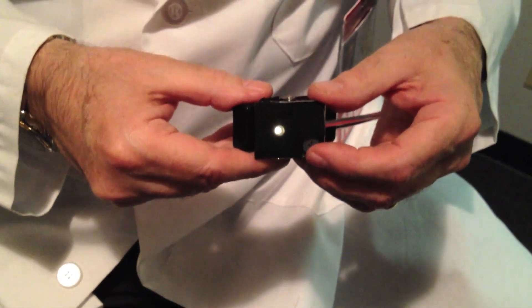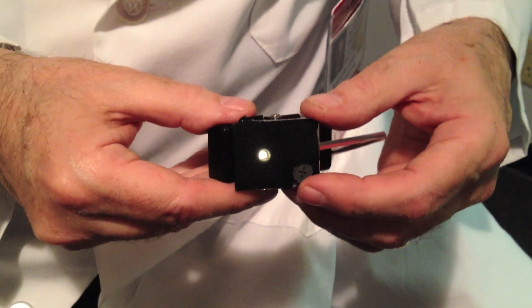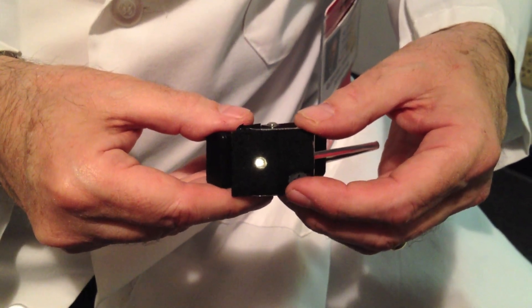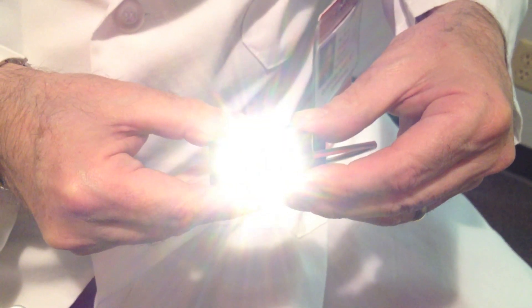The Flip Clip comes with a trim pot, so you can adjust the amount of fill light that you need by simply rotating the trim pot. You can affect the brightness of the light and see how bright it can become.